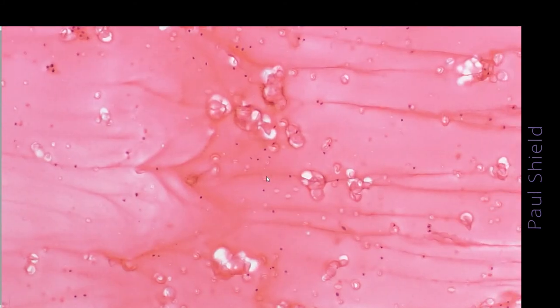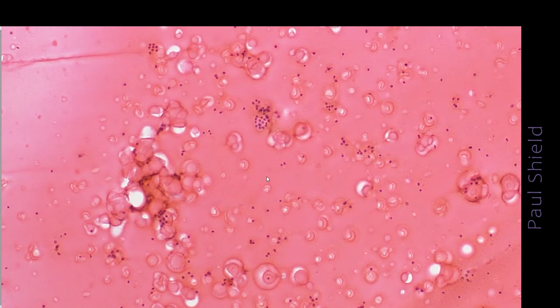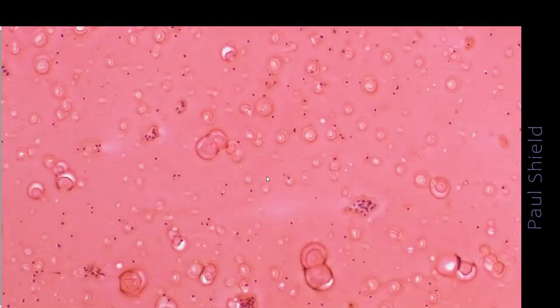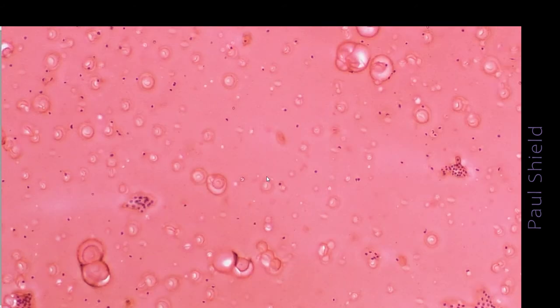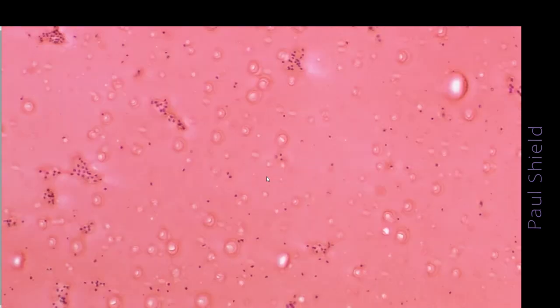This is the pap, and the colloid's looking like a thick nail polish here. We have some macrophages in the background, and then follicular cells. You can see them arranged in little round follicles, as well as being dispersed. It's another rounded group. More little follicles.